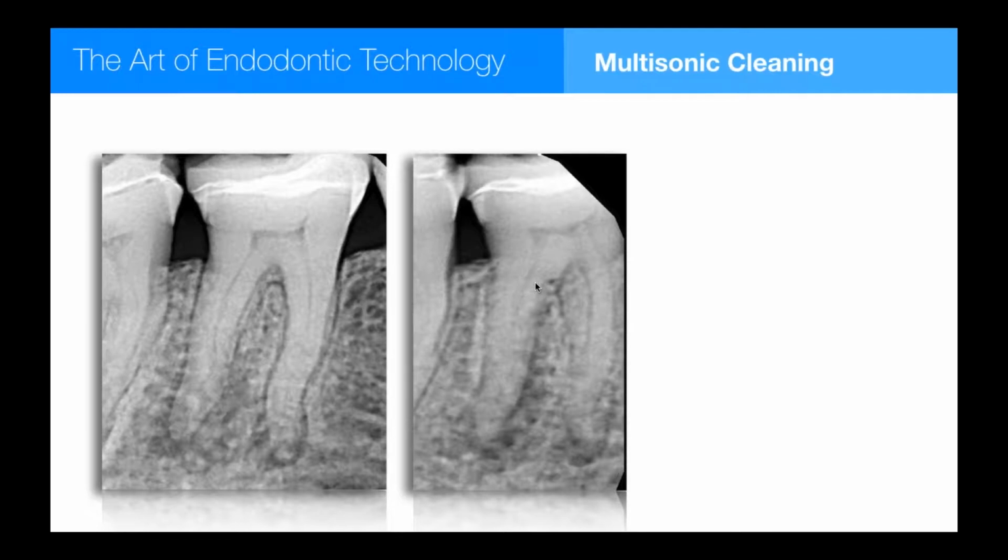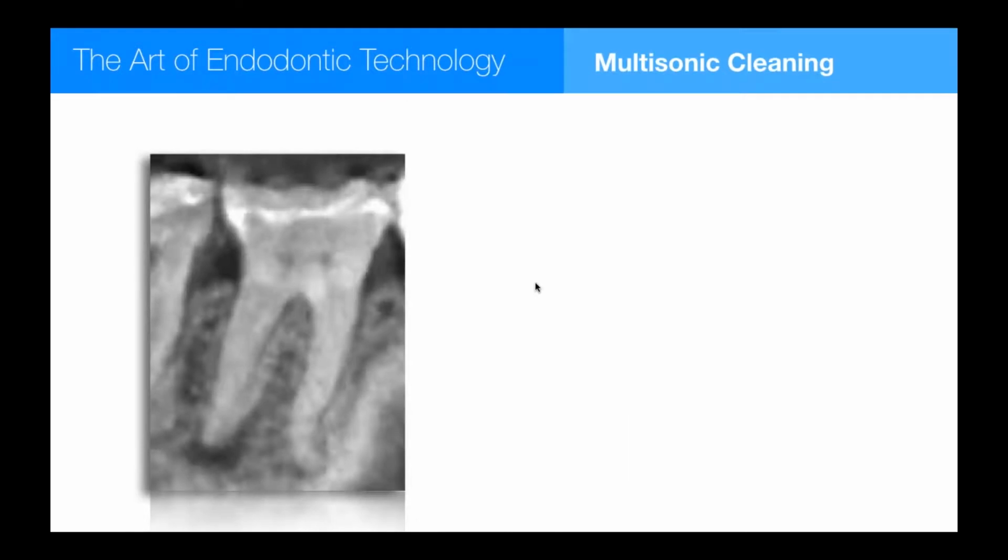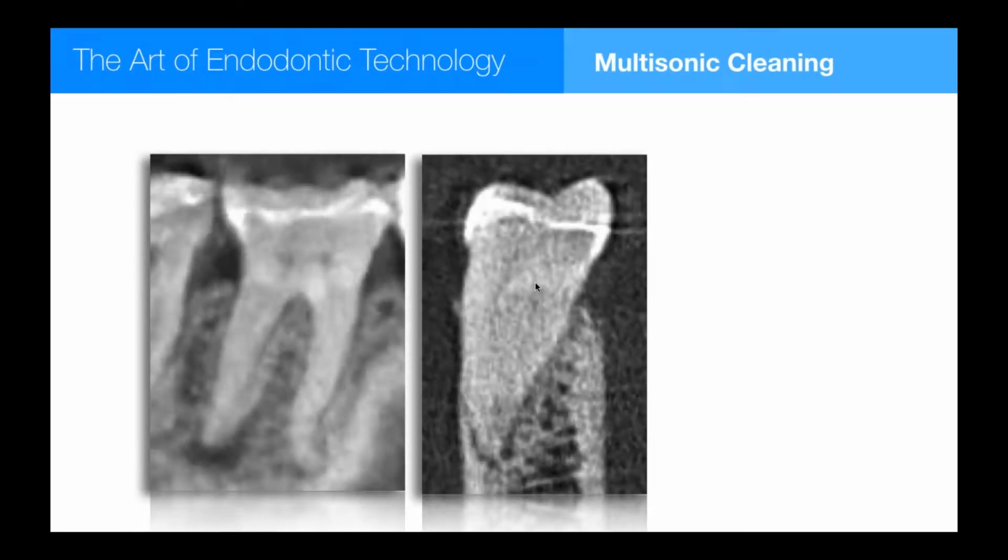Most of these have a huge isthmus space, sometimes 4 millimeters wide at the top by maybe 6 or 7 millimeters long. That's a lot. That's almost half of the canal surface in the whole tooth. So I'm really interested in how this helps us treat that. And here's the CT view showing it's even a little bit more curved than you can tell conventionally. No big surprise. Here's the mesial view of the mesial root.